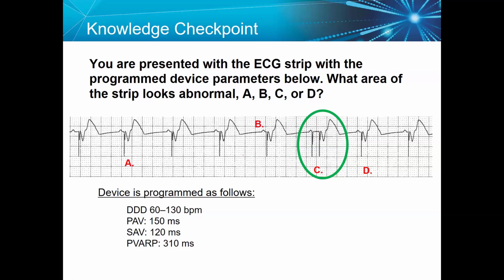Okay, atrial undersensing. Actually, yes, so it is undersensing, right, sir. Here, yes. We see the P wave and it is not sensed. And then after that, a spike, atrial pacing occurred. And it is not capturing because it paced in the absolute refractory period of the atrium.